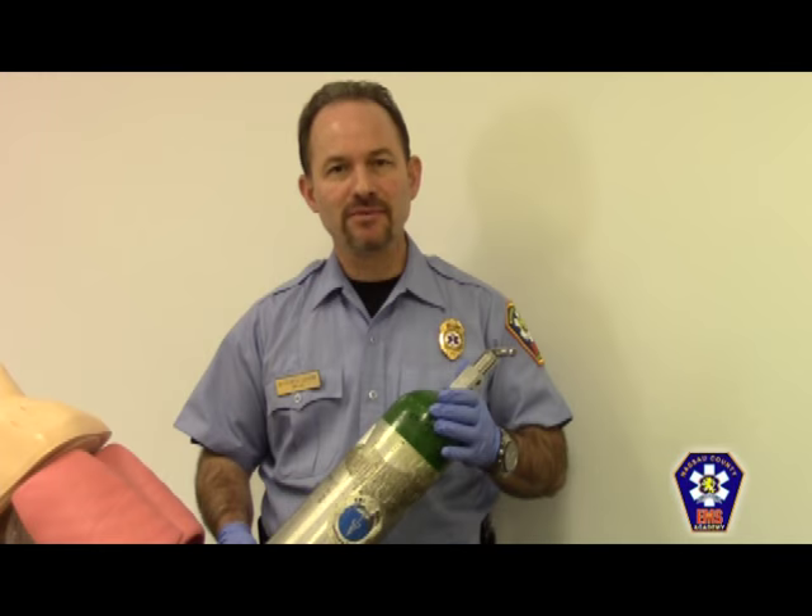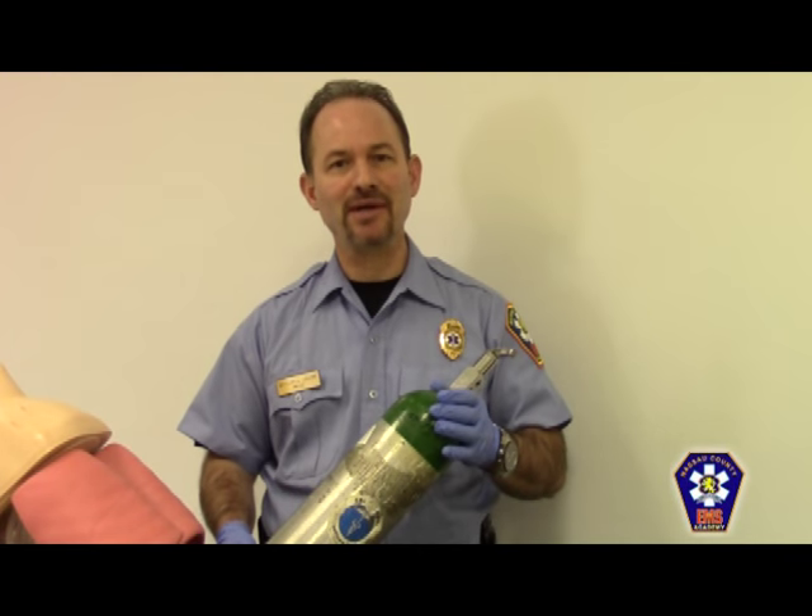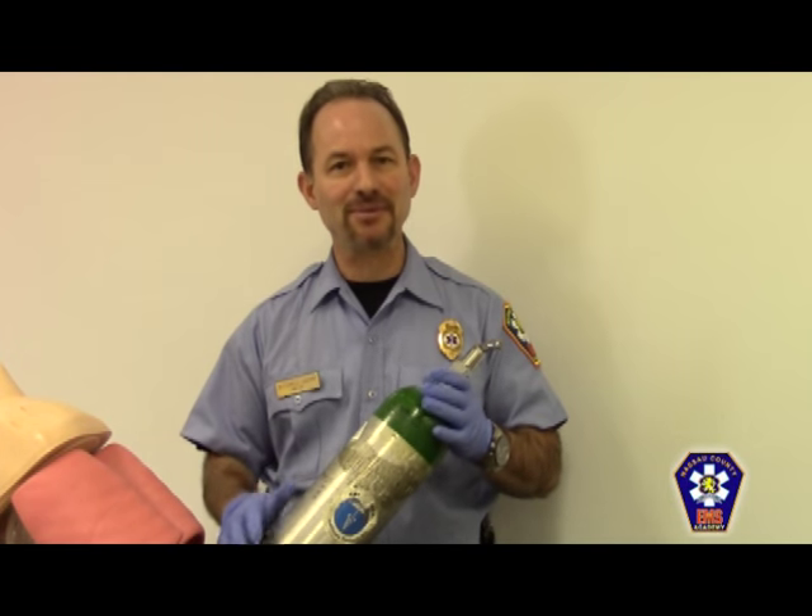I'm going to be demonstrating New York State Emergency Medical Technician Skills Station 4B, Supplemental Oxygen Administration. First, I'm going to indicate to the evaluator that I'm wearing appropriate body substance isolation.